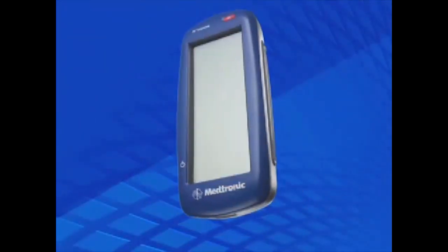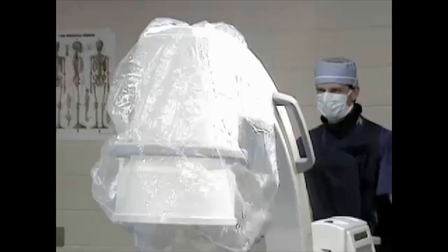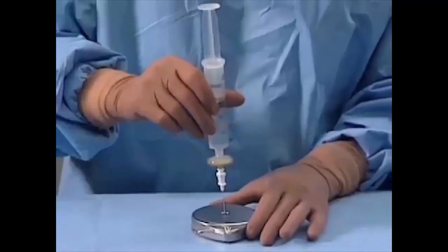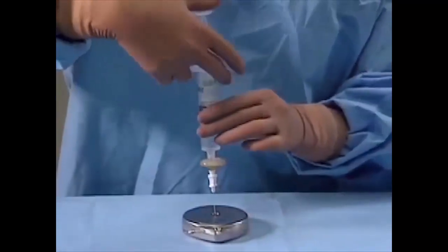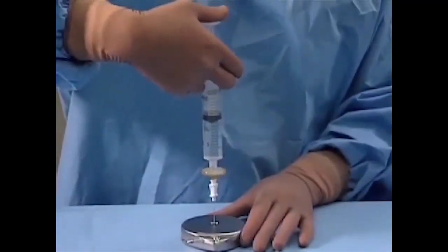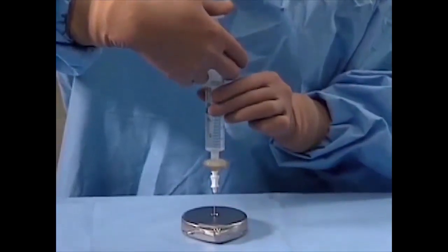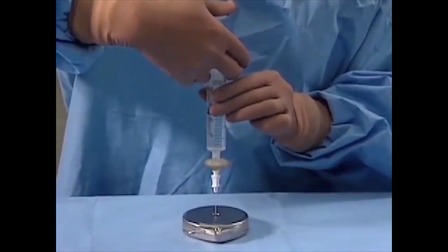and the Medtronic Envision programmer. In addition, have a C-arm fluoroscope available. The pump is prepared once the catheter is placed in the intrathecal space. Please consult the pump preparation segment of this program for supplies and procedures needed to prepare the SynchroMed 2 pump.